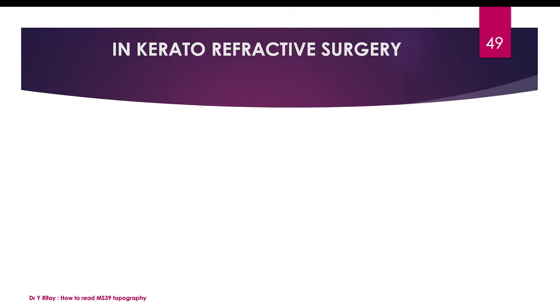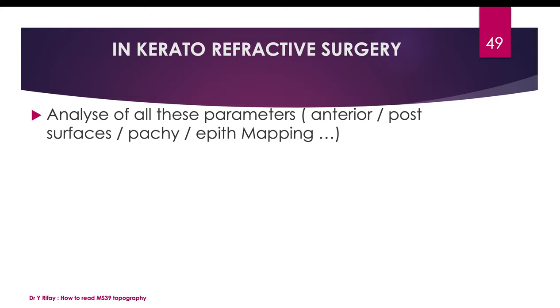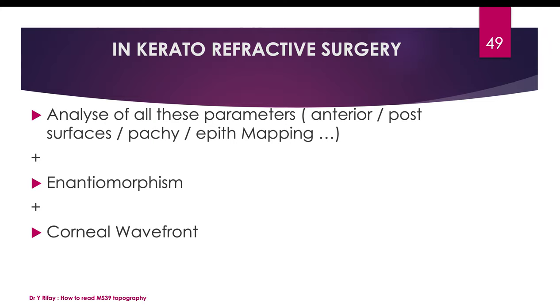In keratorefractive procedures, this device will be very, very helpful. We should analyze all these parameters: anterior surface, posterior surface, pachymetry, epithelial mapping, the pachymetry of the stroma, the pachymetry of the whole cornea. We will add to this the enantiomorphism. We have to examine both eyes and compare them, the corneal wavefront, and add to all this the clinical data of the patient.